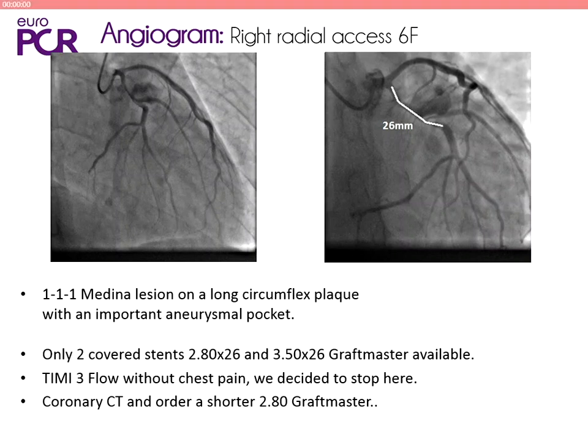In this case, don't you prefer to implant a bare metal stent in order to stop DAPT as early as possible? Thank you for the question, but you know, in Behçet disease you have a high risk of restenosis. So with a bare metal stent, you are sure to have restenosis. But you have to choose between thrombosis or restenosis. Yes, of course I understand, but maybe we have to consider that restenosis is not so dangerous. Of course, that's very reasonable, but as you said, it's between Scylla and Charybdis. You don't know which way to go. With both, you have a problem.